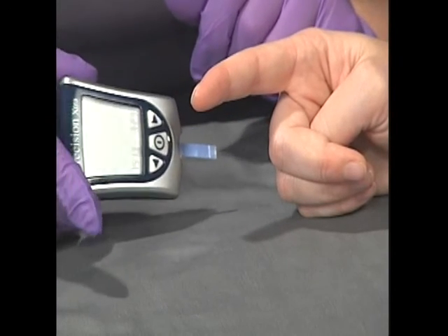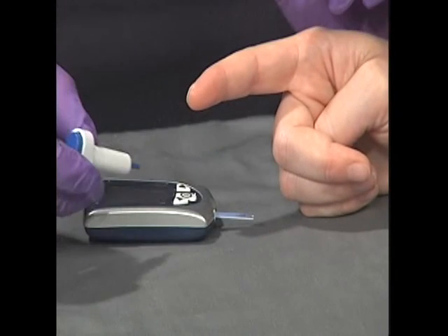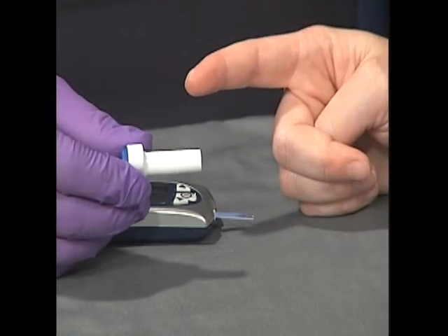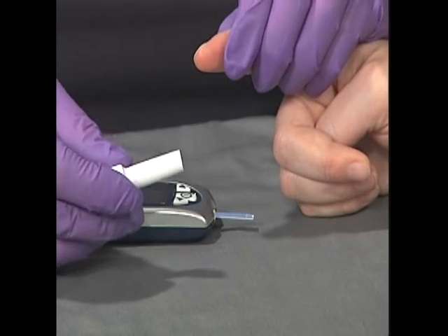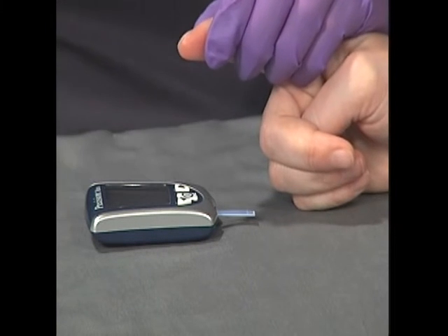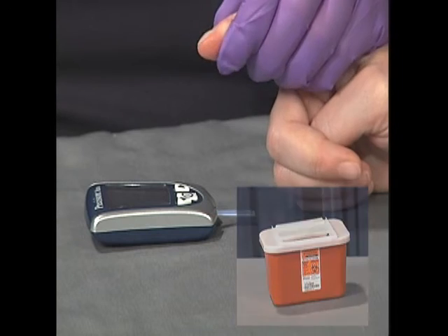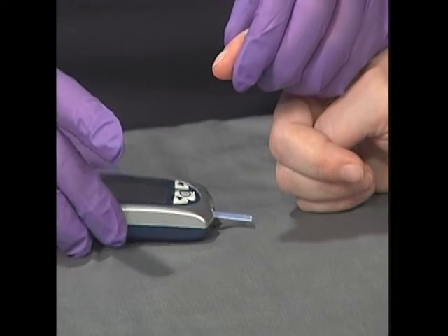Poke the finger with the lancet to obtain the blood sample. It's often easier to obtain a blood sample if you're able to milk the finger in order to get more blood to the distal tip. Make sure to place the lancet in the sharps container. Some protocols may suggest wiping away the first drop of blood and using the second for the sample reading.